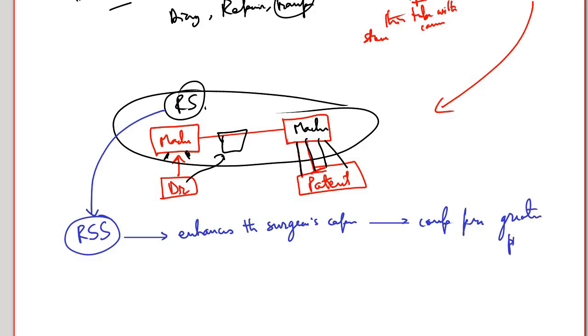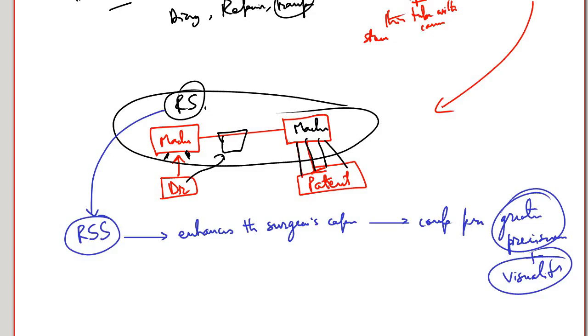This is the need of the time, precision, okay, as well as visualization, as I showed you in the picture, it can see, and this is just not possible, the visualization as well as higher precision with traditional surgery, okay.